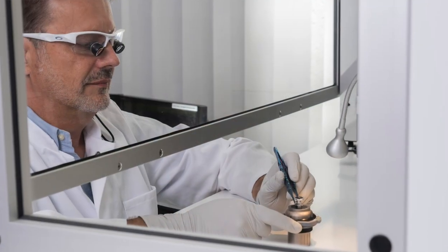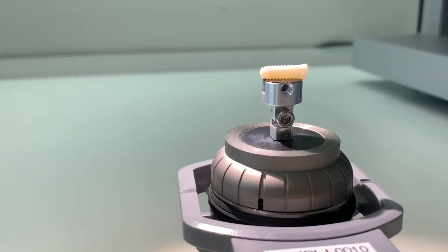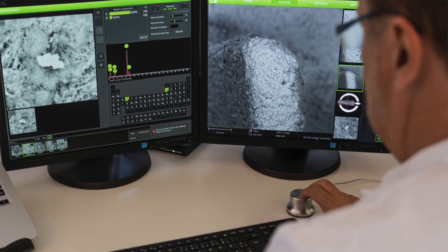Comments made by manufacturers regarding these figures focus on patients. Patients with unfavorable clinical preconditions and even blame us, the dentists, for our lack of experience and training. Is this the whole truth? In our recent quality assessment study, conducted in collaboration with the Charité University here in Berlin, we unpacked more than 100 different sterile packaged implants in a clean room environment, including ceramic and titanium implants, and performed with these implants elemental analysis of the surfaces in a scanning electron microscope. What I found in the microscope is presumably beyond your imagination.